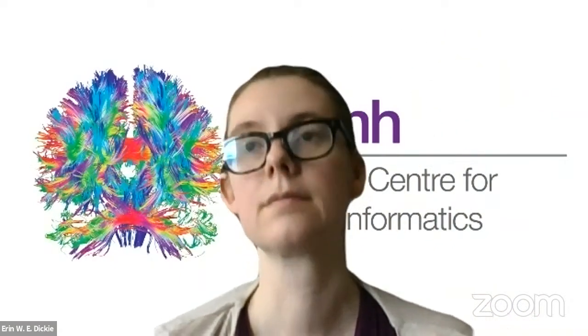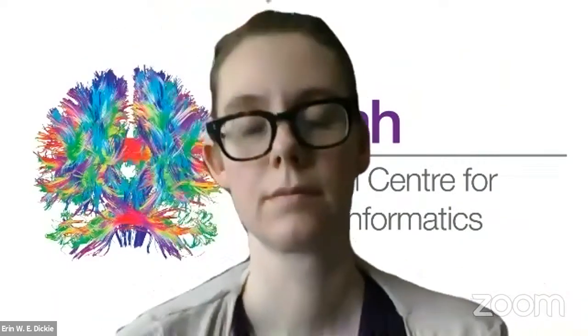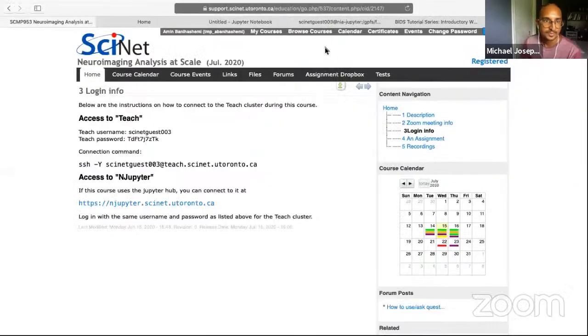So Amin, would you feel comfortable sharing your screen to figure out where the datasets are? Could we give Amin access? Okay, there we go.